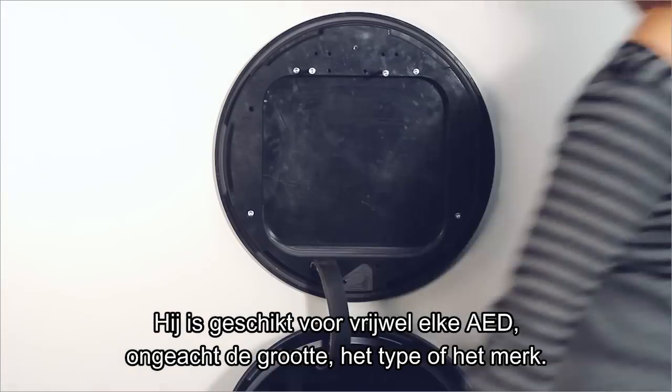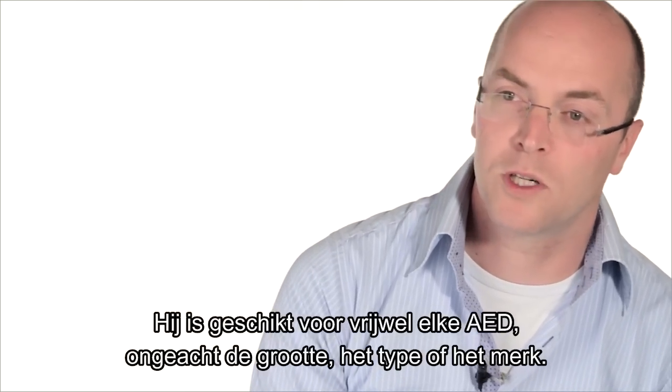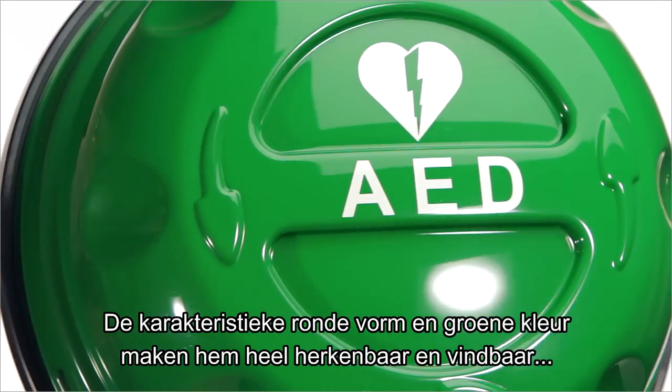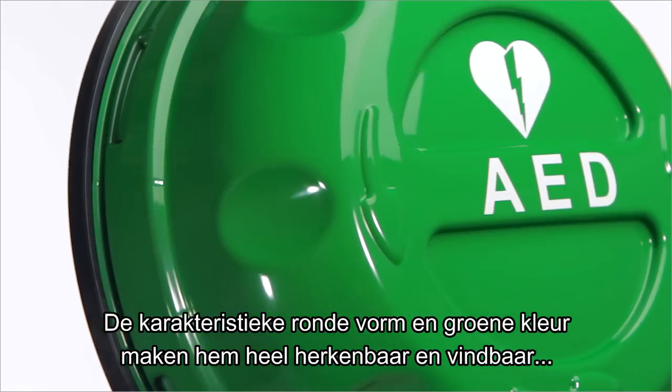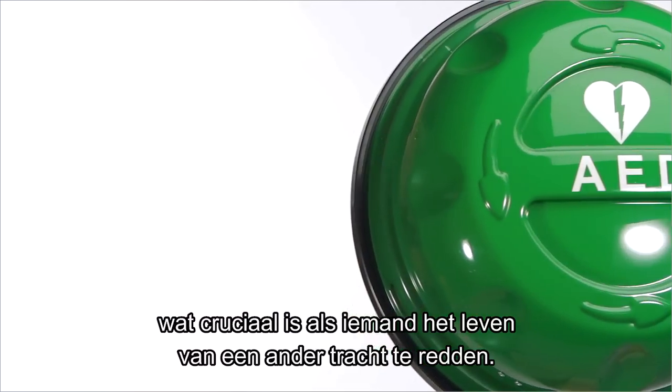It suits practically every AED on the market today, no matter what size, type, or brand. Its characteristic round shape and green color make it easy to find and recognize, which is of course crucial when you need someone to save someone else's life.